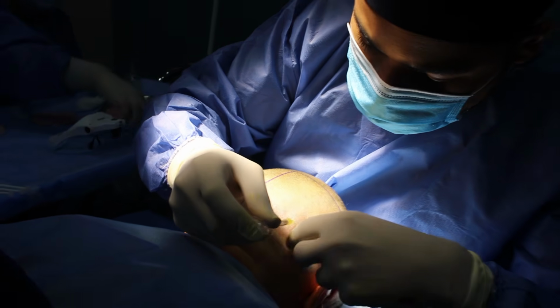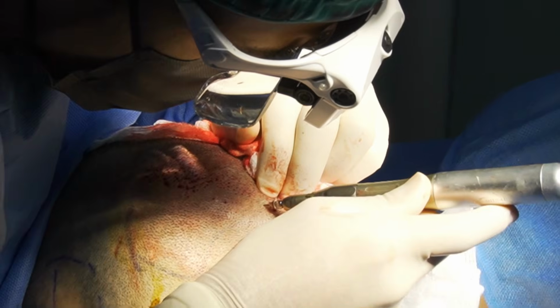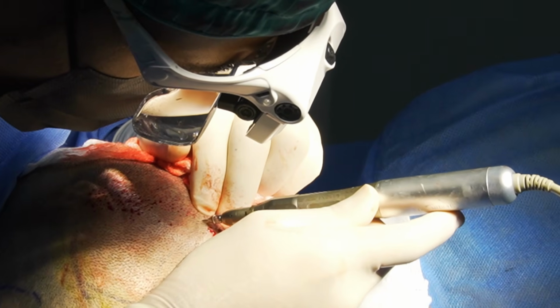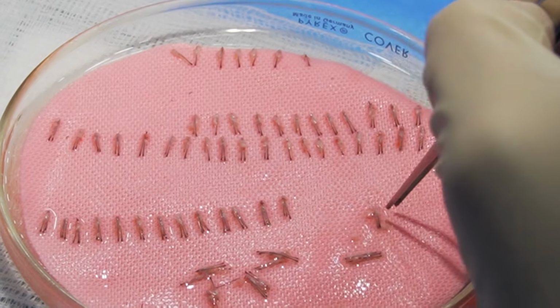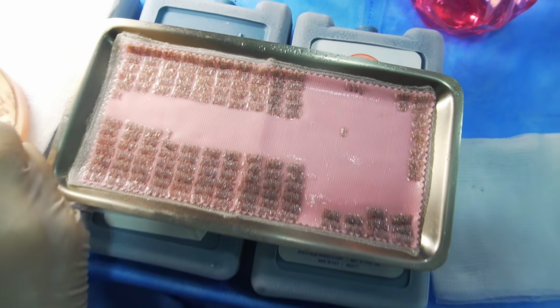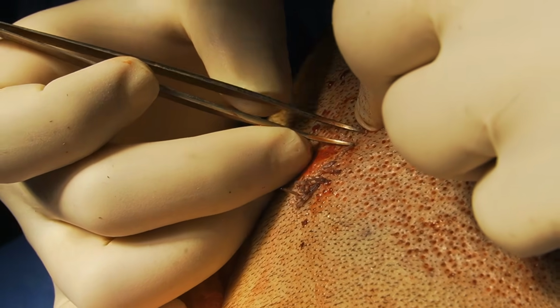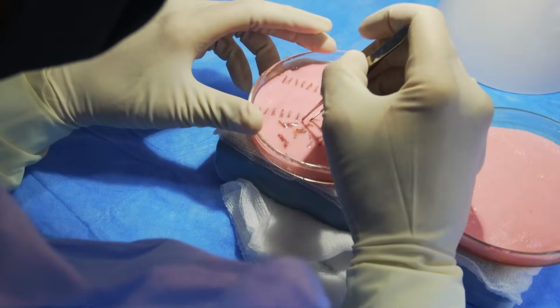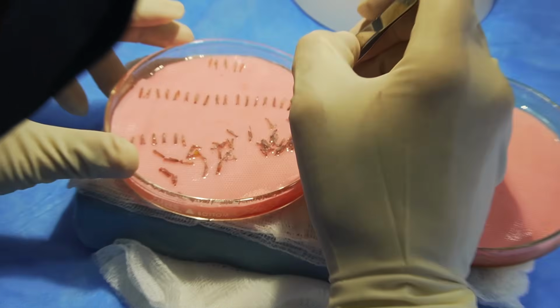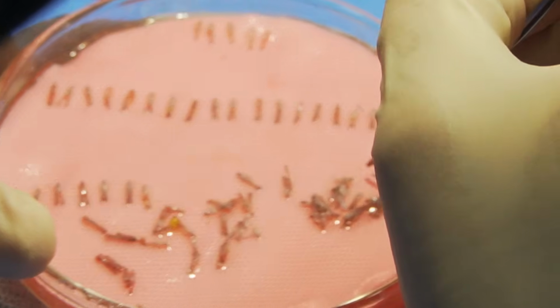Step 3. Preparation and anesthesia. The donor area is carefully prepared, and local anesthesia is then administered. This allows the follicles to be extracted while keeping the patient comfortable throughout the procedure. Step 4. Follicle extraction. The follicles are extracted individually from the donor area using specialized micro-instruments. Each follicular unit is handled carefully to protect its structure and preserve its viability. Unlike techniques that require the removal of a strip of scalp, this procedure does not involve a linear incision or require stitches. The extraction is performed follicle by follicle. This also allows the extraction points to be carefully distributed, preserving a uniform appearance in the donor area.